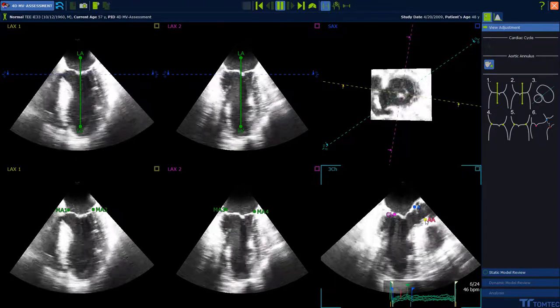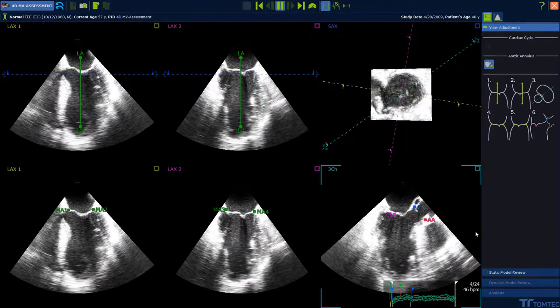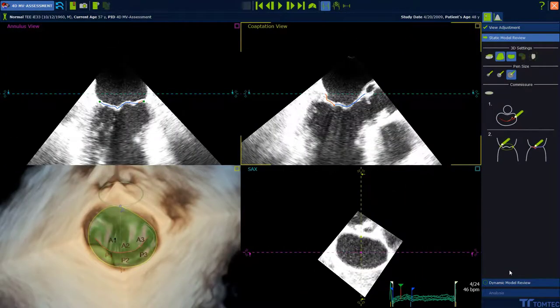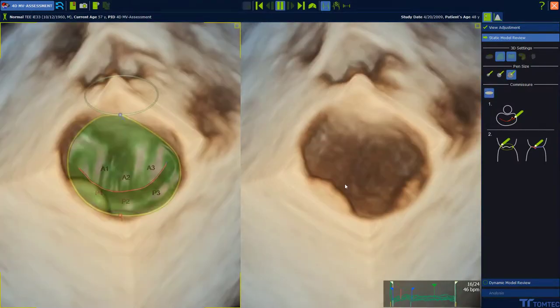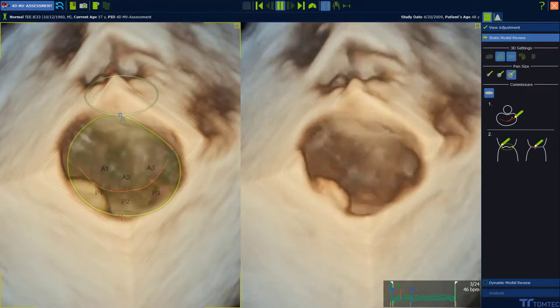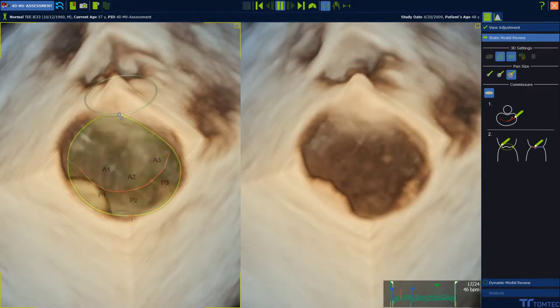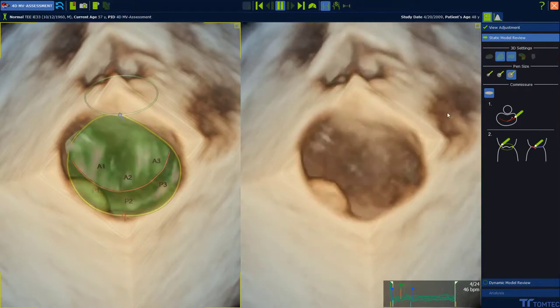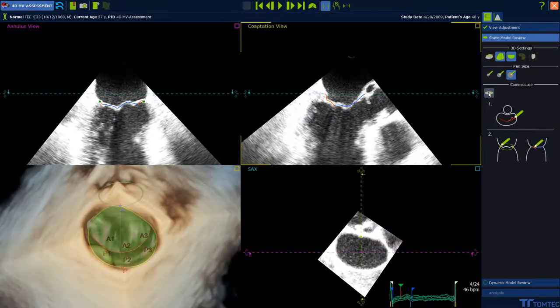To continue, press static model review. You can select one pen size. A recommendation: select a small pen for a small correction. To adjust the position of the commissures, activate the button on the right-hand side. Adjust the commissure points if necessary. And deactivate the submenu by clicking the button again.